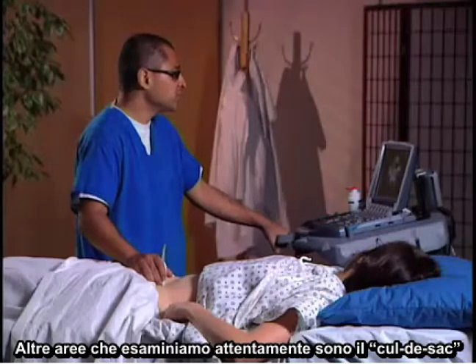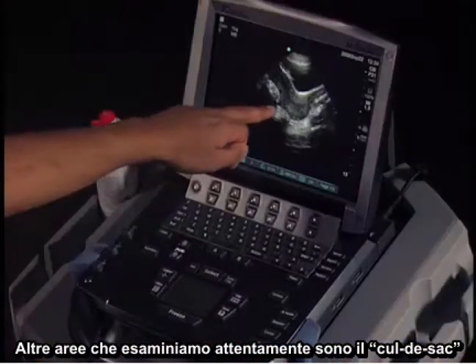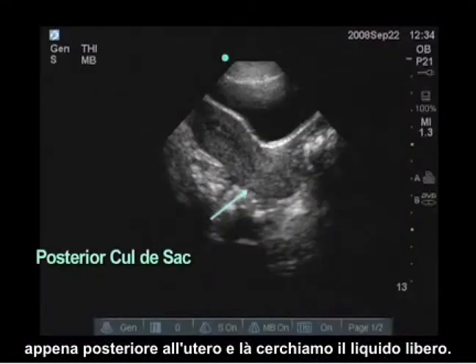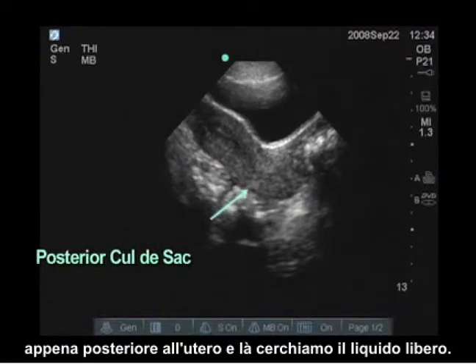Other areas we're going to carefully examine would be the cul-de-sac, which is just posterior to the uterus. There, we're going to look for free fluid.